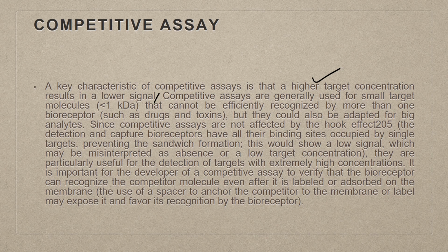Competitive assays are generally used for small target molecules, less than 1 kilodalton, that cannot be efficiently recognized by more than one bioreceptor, such as drugs or toxins, but they could also be adapted for big analytes.